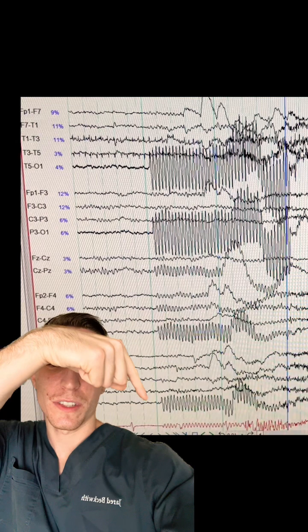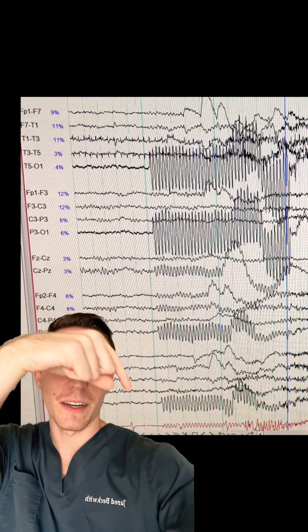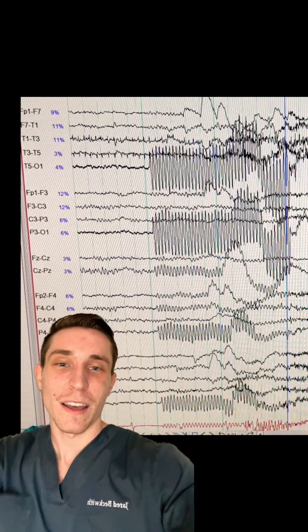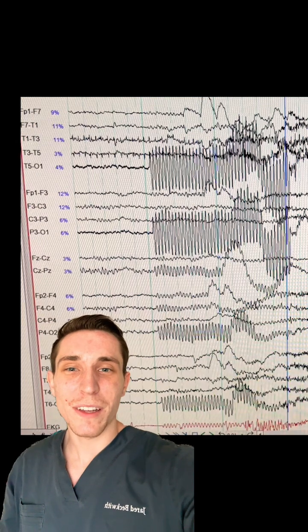Now, you can also see that the EKG channel is being contaminated by this electrical signal as well. Now, what was it?